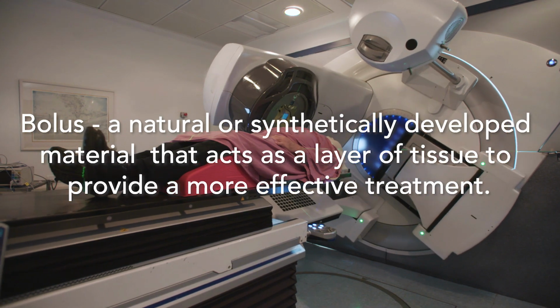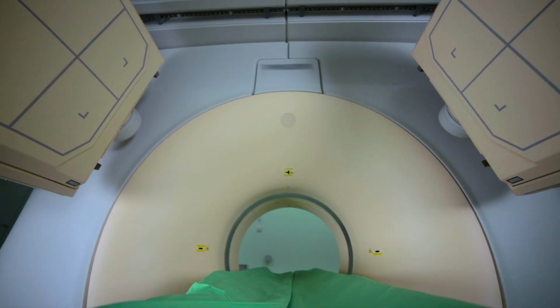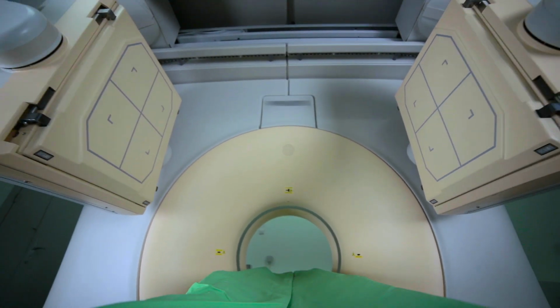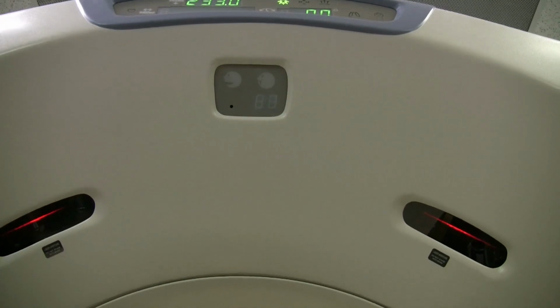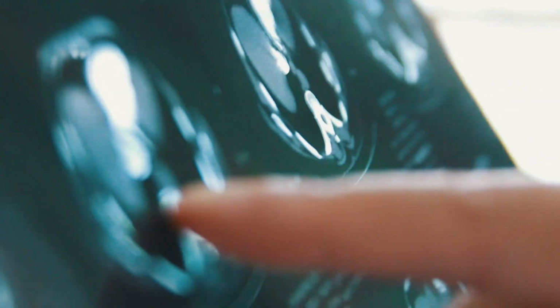The radiation beam requires a certain amount of material to build up the dose. If we're trying to treat close to the skin in the patient, the one primary use is something we call bolus. Normal radiation that we use doesn't get full dose to the skin, so you need to put something on the surface to build up the dose, creating areas where we can better shape the dose to where we want to get the dose.